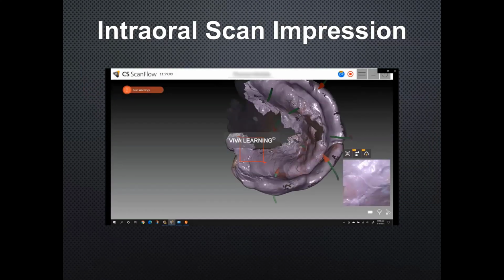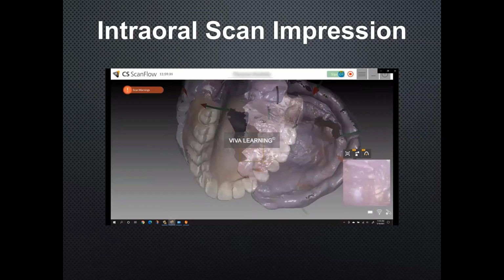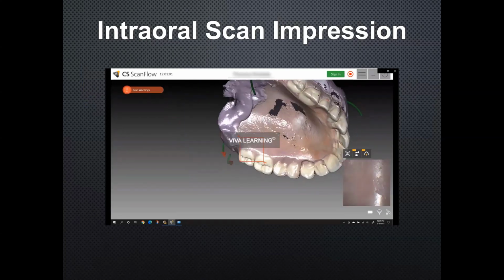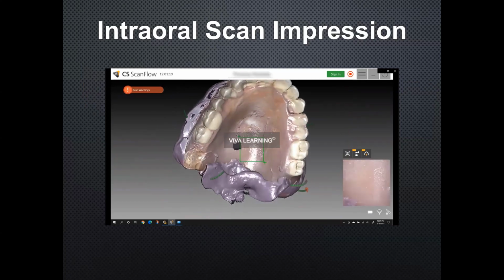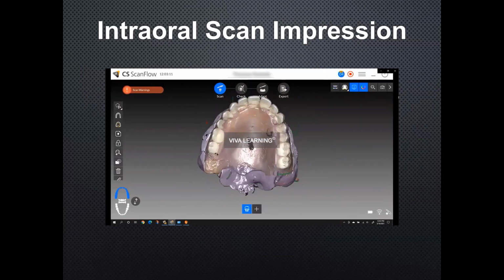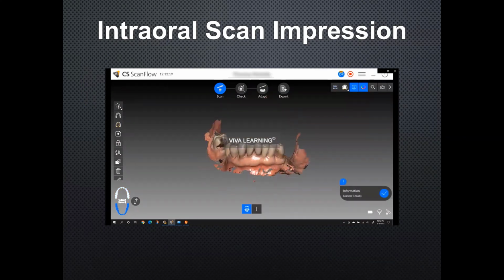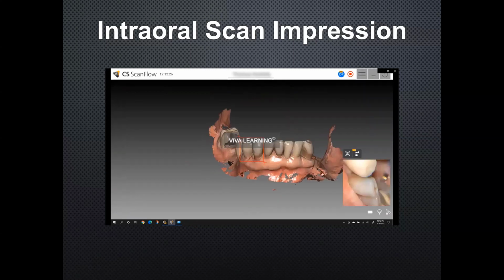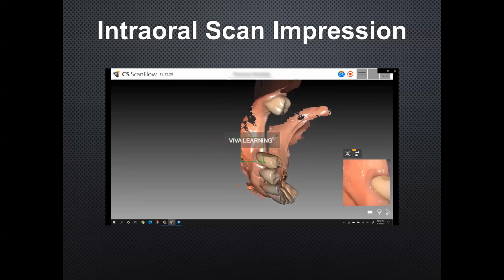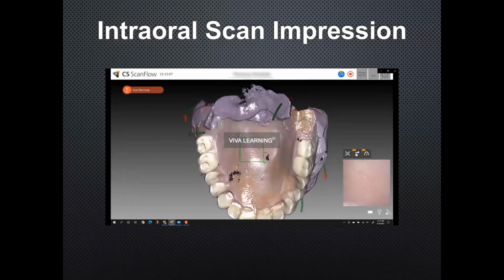Here's a picture of the intraoral scan that we'll utilize. His denture had a nice enough occlusal scheme that we could utilize that, but we wanted to make sure we also made him a new denture in this final prosthesis. So we lined that original denture with Impregum. While it was in the mouth, I took the excess of the Impregum away from the buccals and lingual so we could nail his bite registration.